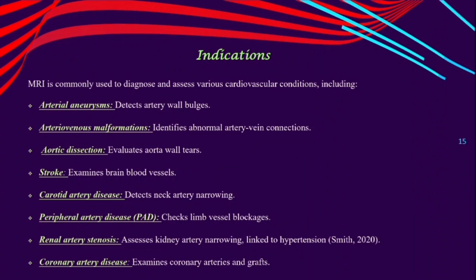Indications. MRI is commonly used to diagnose and assess various cardiovascular conditions including arterial aneurysms, arteriovenous malformations, aortic dissection, stroke, carotid artery disease, peripheral artery disease, renal artery stenosis, and coronary artery disease.